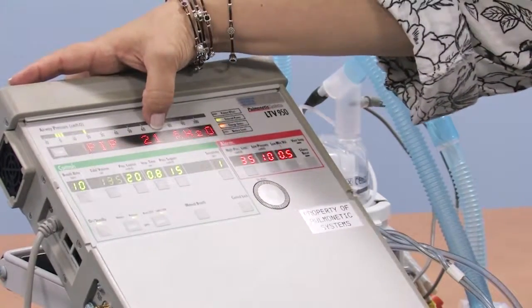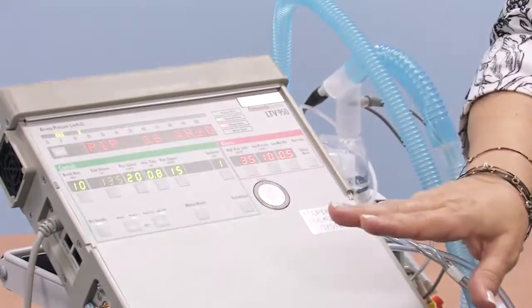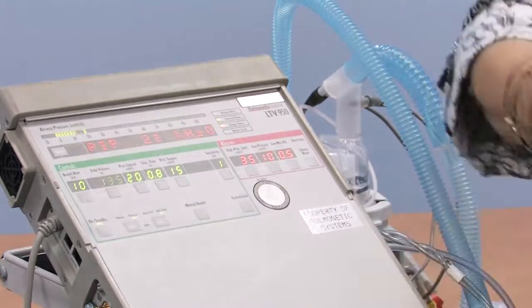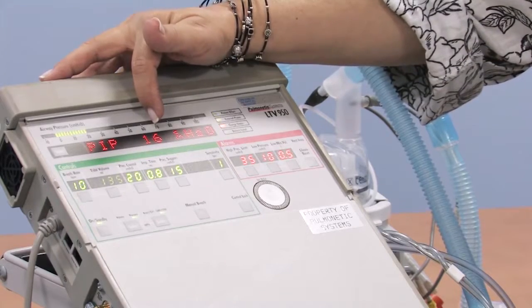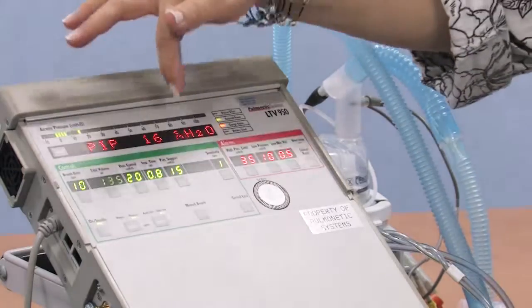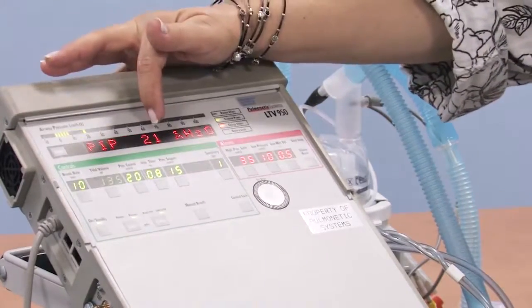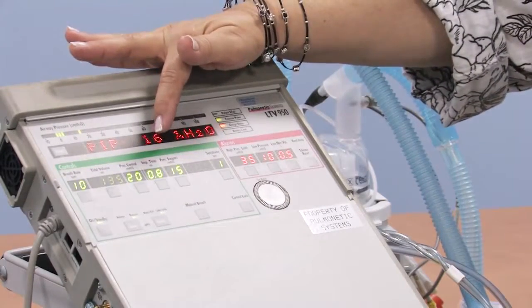The first value I like to look at is the PIP, peak inhale pressure. Well, we've told the ventilator to go up to 20 for those 10 mandatory breaths and assist our patient, our child, up to a pressure of 15 when they want breaths. So we should see around 20 or around 15. And this is the window that's reading from these two little hoses up here. So these are not set numbers, they are measured numbers, and they may vary a little bit. Like you see, we have 15 and 16 and 20, 21. Things can be off by just a little bit. These are the settings, these are the measurements, the live measurements.